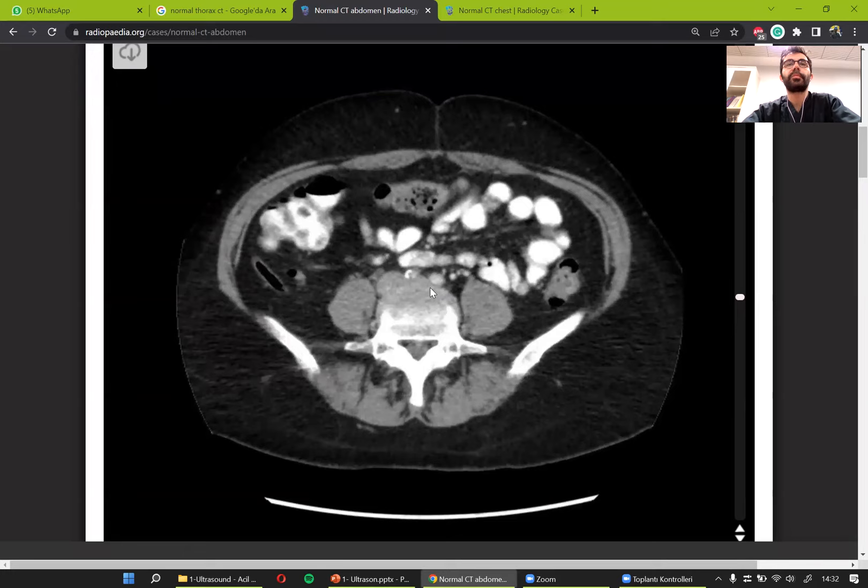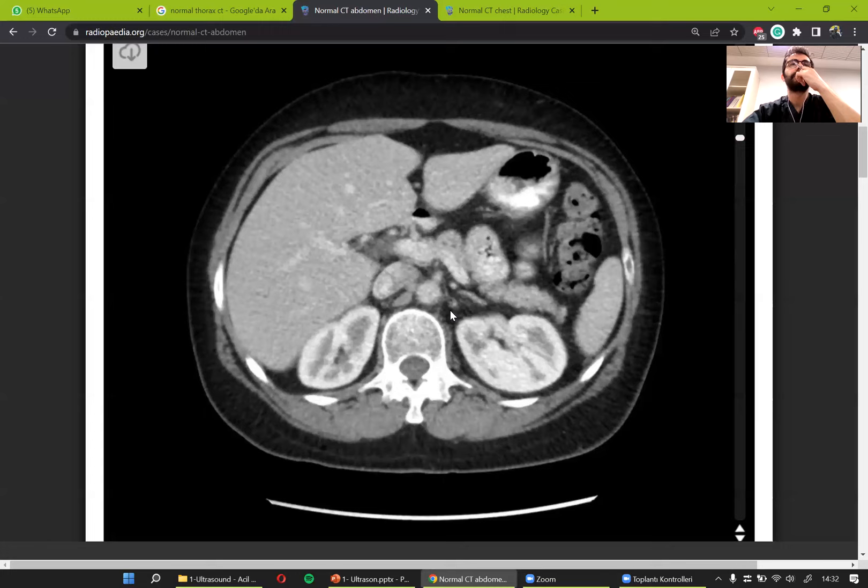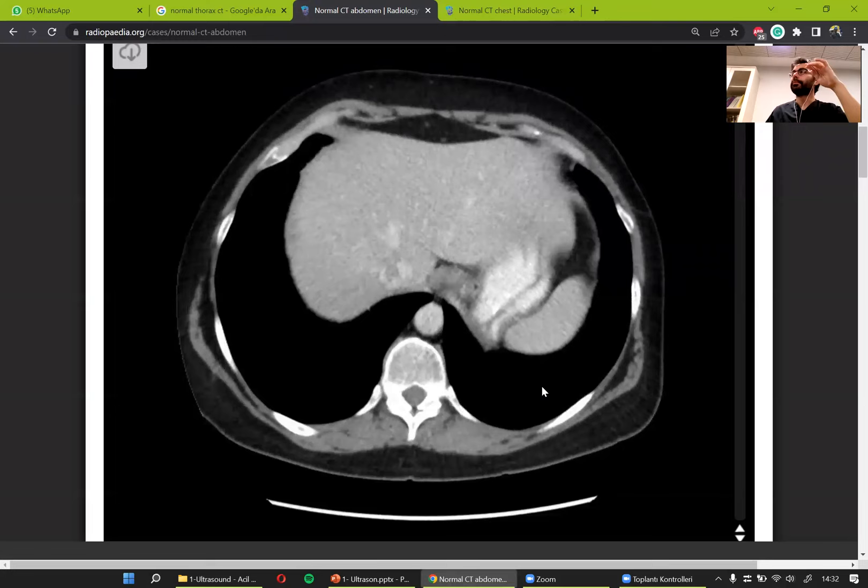Coming back up — these are the iliac vessels. They go up and originate from the aorta. The student confirmed it was clear.